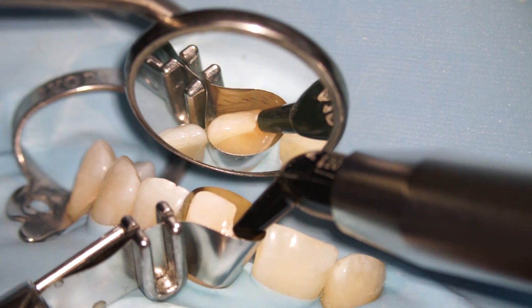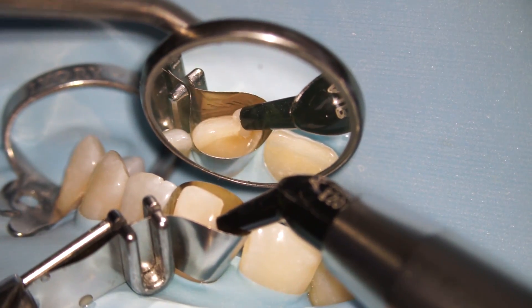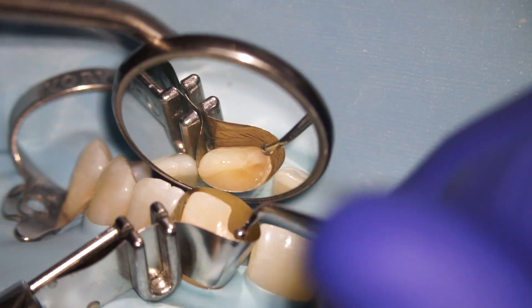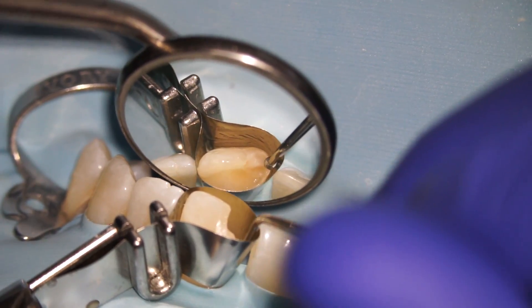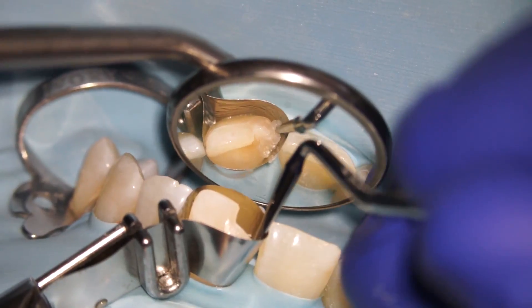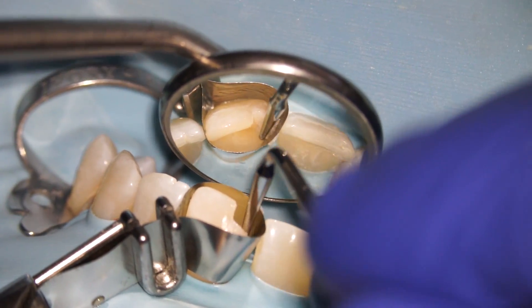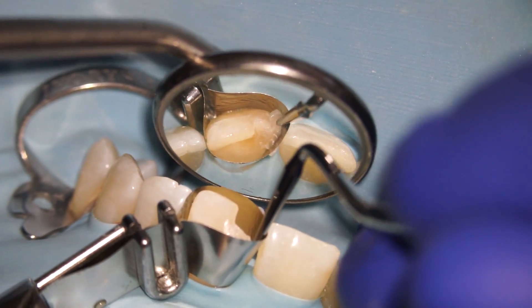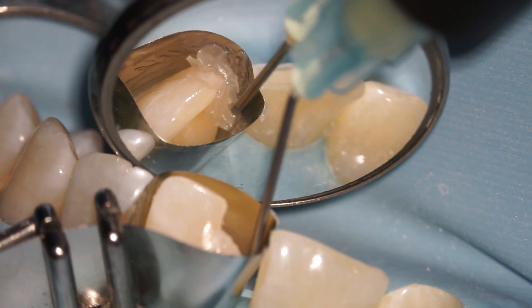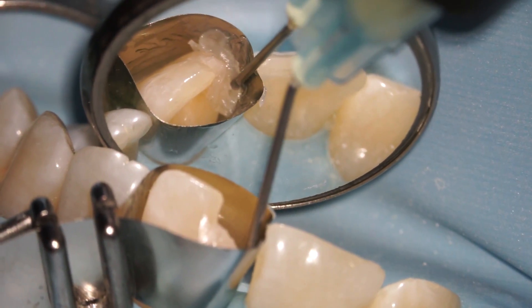The filling comes out in a putty form, like play-doh essentially, and then we just mold it to get it where we want it to go. I use two different colors here. The first color is trying to replace the second layer of the tooth, which is the dentin, and then once we're done with that we add the second color which is more to replicate the enamel of the tooth. Sometimes we use a little bit of fluid filling to get the layers to adhere together better.